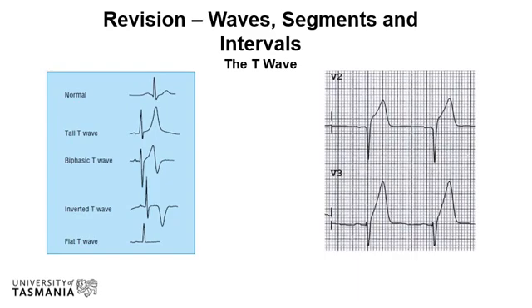And there are many possible causes of T wave changes. A changing T wave may be a sign that something is abnormal. However, it may also be just a normal variant, especially in children. T waves can be peaked, normal, flat, or negative.